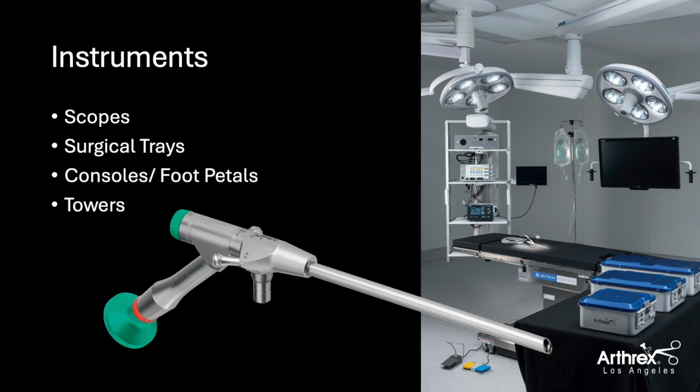I think it's also important to understand that we look at the consoles. We have an RF generator specific for spine that's different than the sports arthroscopy generator. And also we have a spine drill NSK system that's going to be accompanied on some of these cases as well. It's important to make sure you have those 2 things with the associated foot pedals.